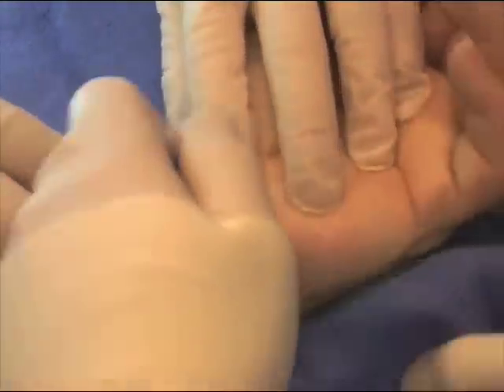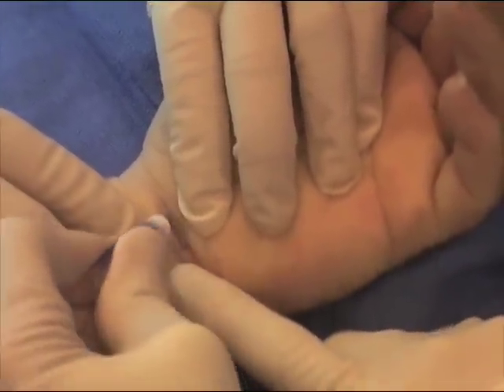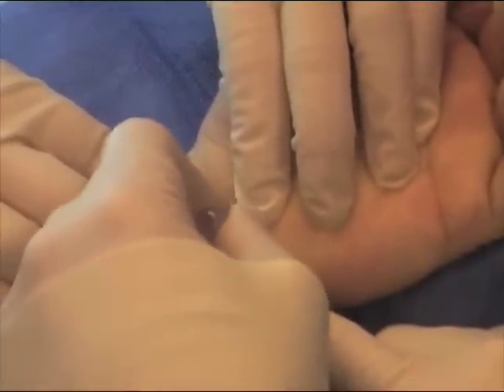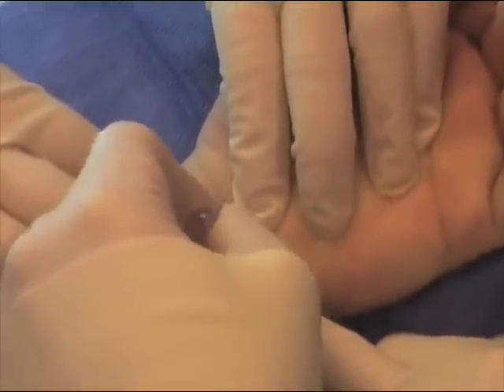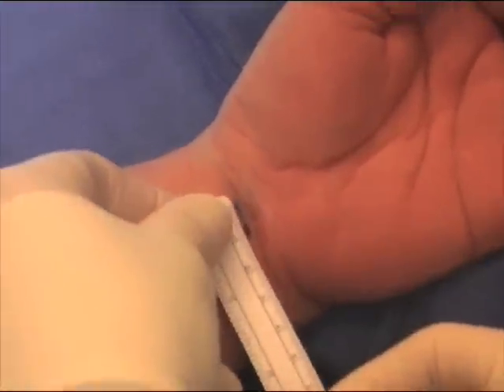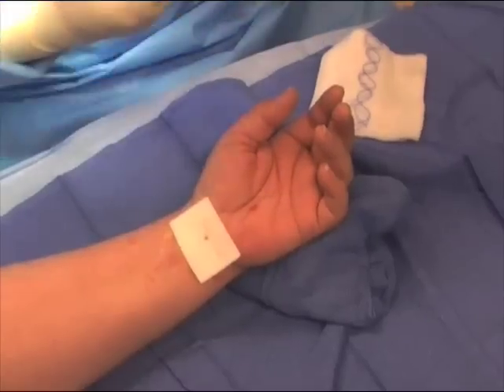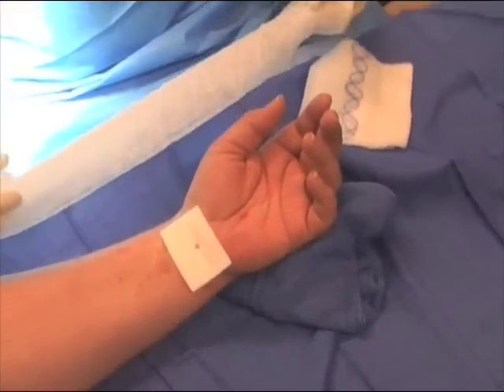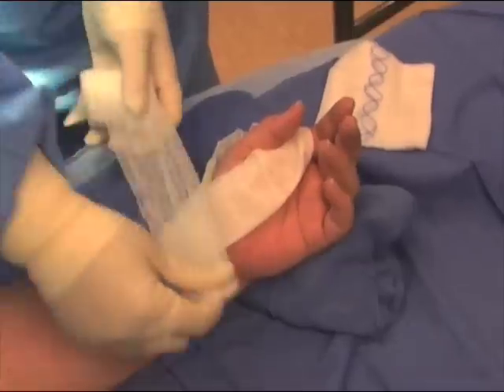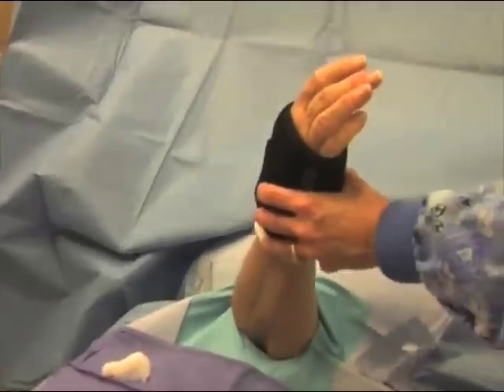The skin has been closed with Dermabond, or medical superglue, and the incision measures about 5mm. A small, light bandage is placed. Patients have very little pain afterwards and are able to use the hand immediately, taking only Tylenol or Advil.